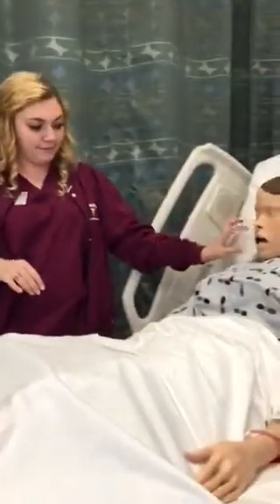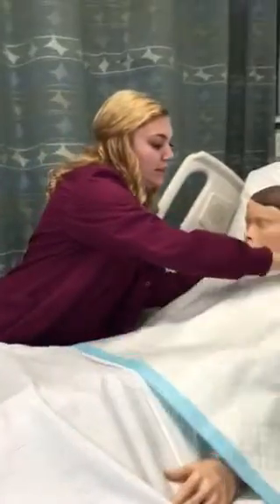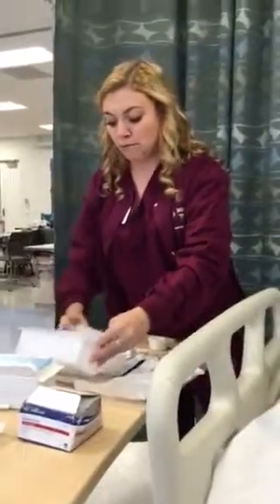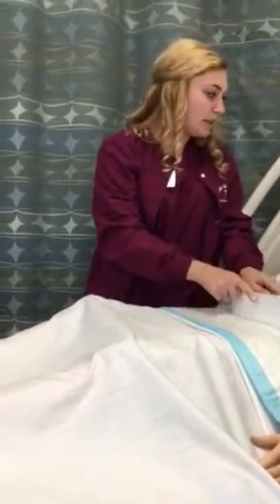So I'm going to give them a tissue so they can blow their nose. And then get a towel. This is just in case they start to vomit. I'm also going to give them an emesis basin in case she starts to vomit. So if you start to vomit, you can go ahead and vomit into here.